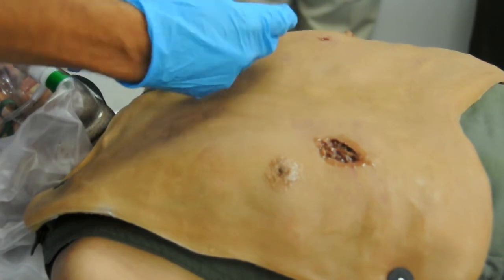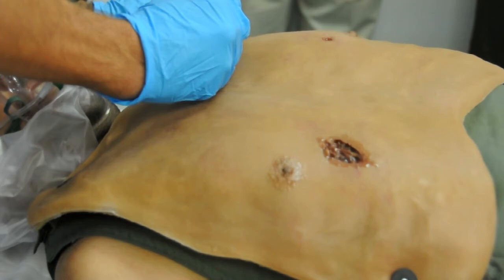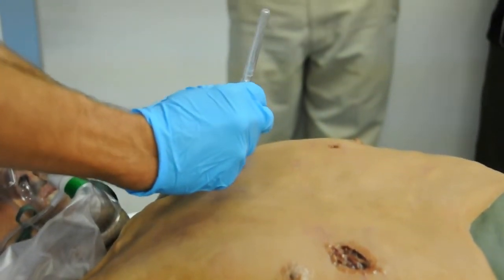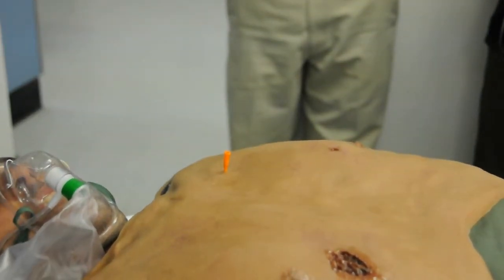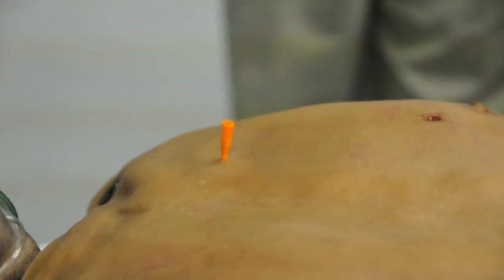And as you pop through, obviously you've got that needle. You don't want to create more damage, so you're just going to insert the catheter over the needle into the lung space, decompressing the chest. And that will buy you time until you can then place a chest tube under more controlled circumstances.